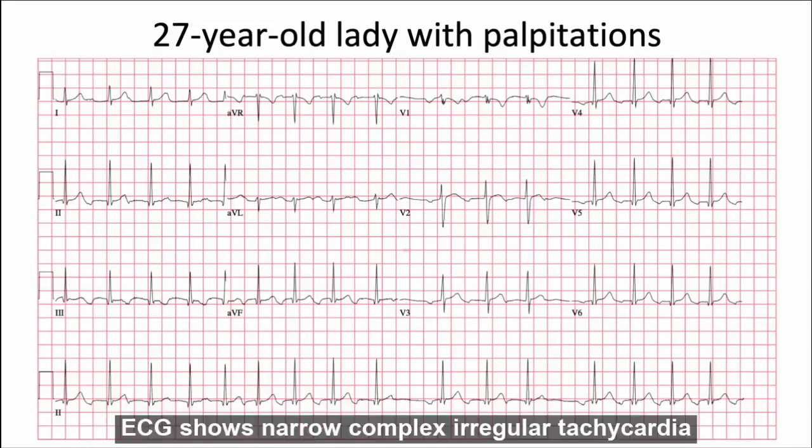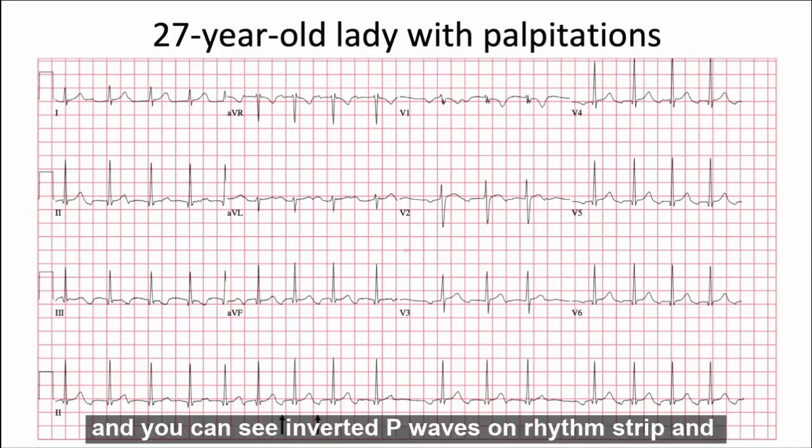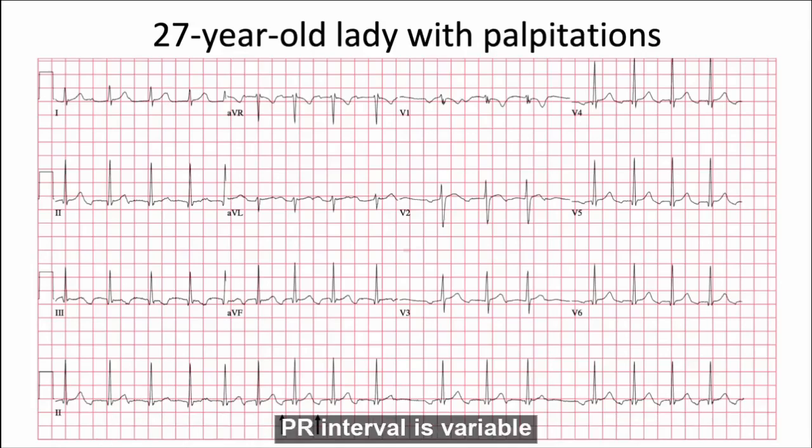The ECG shows narrow complex irregular tachycardia. You can see inverted P waves on the rhythm strip and the PR interval is variable.